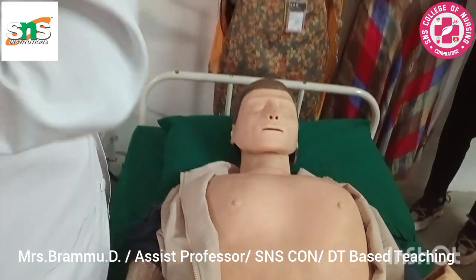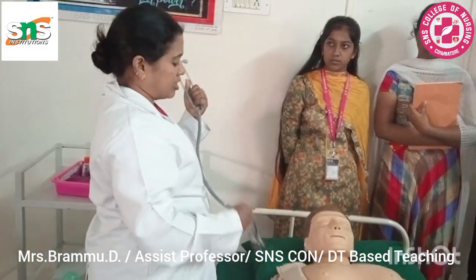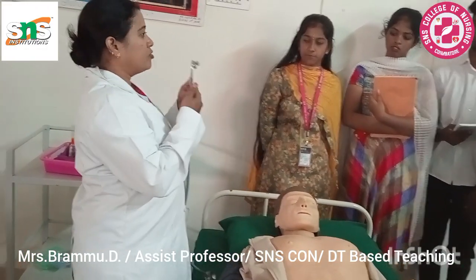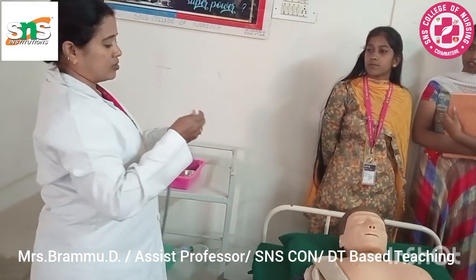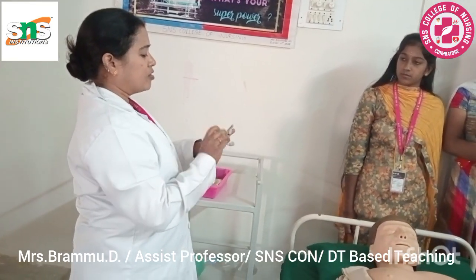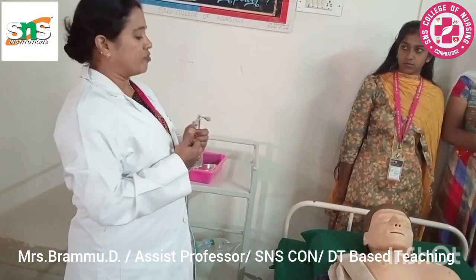So now can we auscultate? Before you start, always check whether the stethoscope is working, because here you have the on and off switch. In order to be more precise, you can use your sterile cottons and always disinfect the earpiece in a rotatory technique, so that the healthcare worker is not going to develop any ear infections.